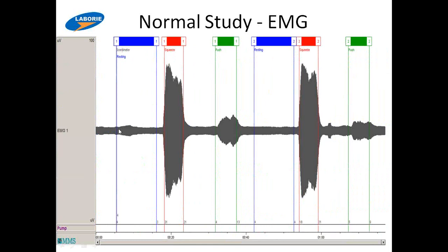Now, here's a caveat. I told you, you have to look at the whole picture. He doesn't have outlet obstruction, like his puborectalis won't relax, which you would think about with an elevated push voltage. He doesn't have that. His symptoms are the opposite. They're a little smear of fecal incontinence. So some people, you have to think, okay, is this guy just having trouble pushing because I'm sitting here and he's in this position? This is very abnormal conditions.